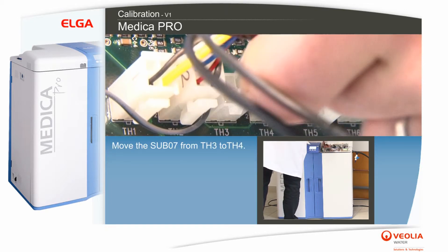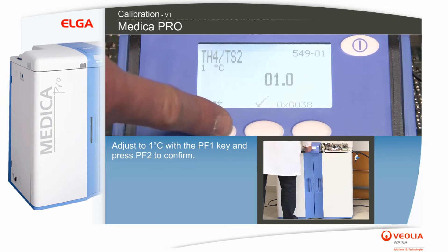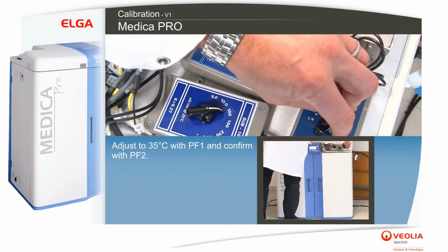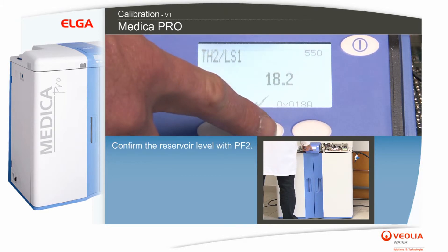Move the sub-07 from TH3 to TH4. Adjust to 1 degree Celsius with the PF1 key and press PF2 to confirm. Adjust to 35 degrees Celsius with PF1 and confirm with PF2.